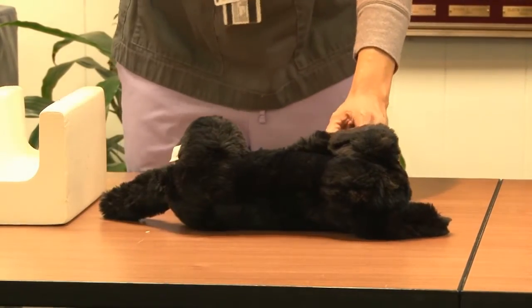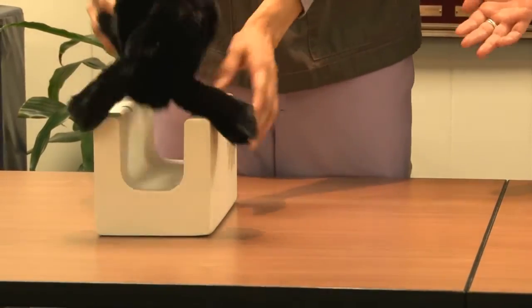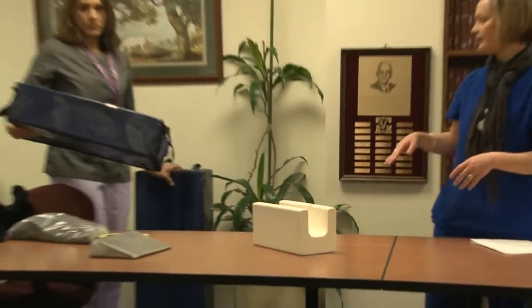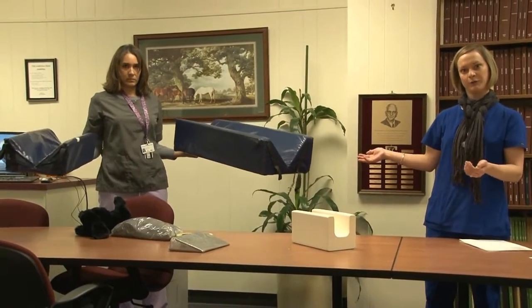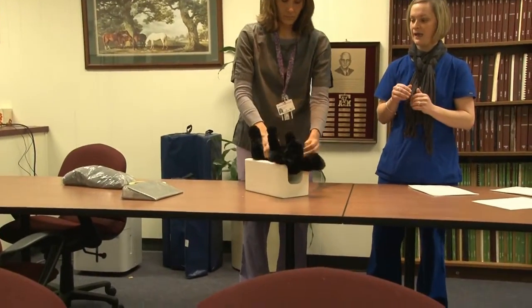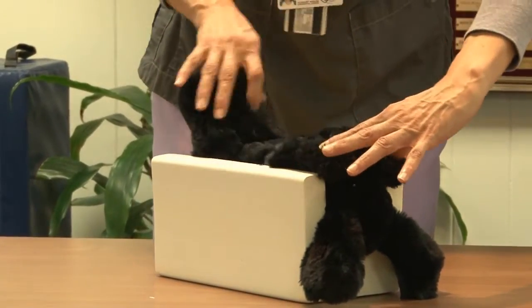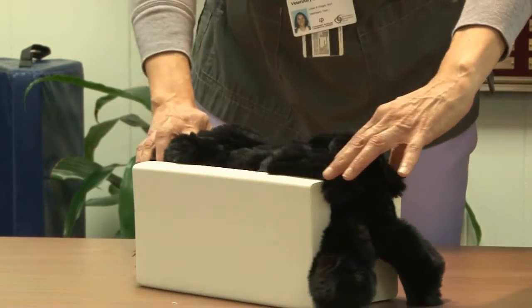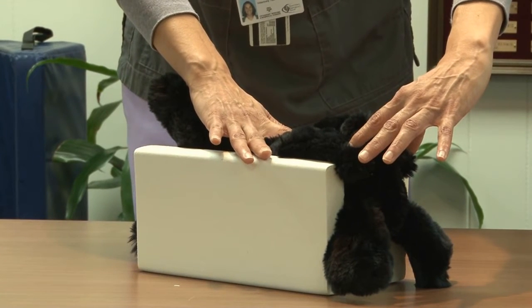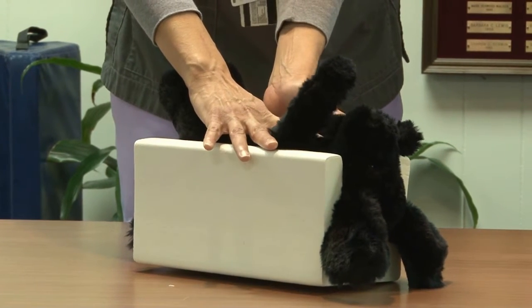Next we move on to the ventral dorsal thorax. We use troughs in radiology that help position the patient — they work much better. We've got all sizes, really small ones and really big ones for larger patients. Place the patient on their back, extend the front legs cranially towards the head, and the back legs caudally away from the abdomen. Make sure the patient is not rotated — place your hand on the sternum and feel underneath the back to make sure those line up perpendicularly with the table.